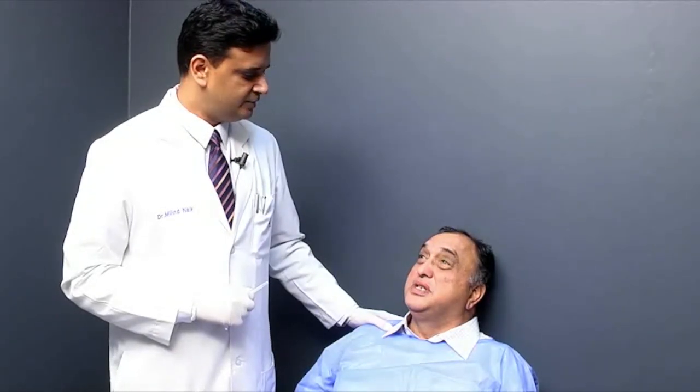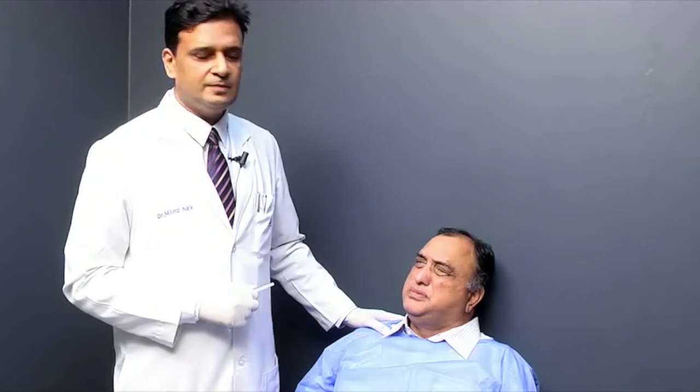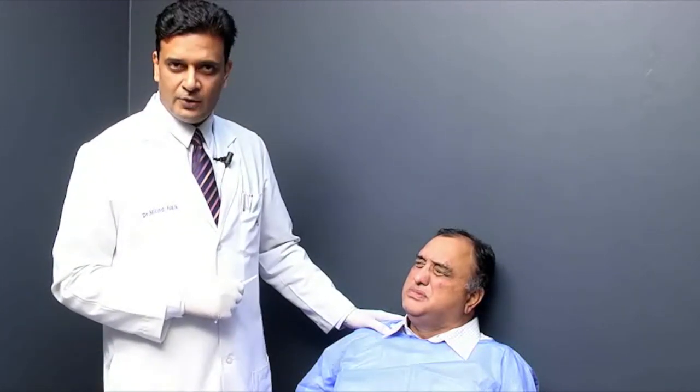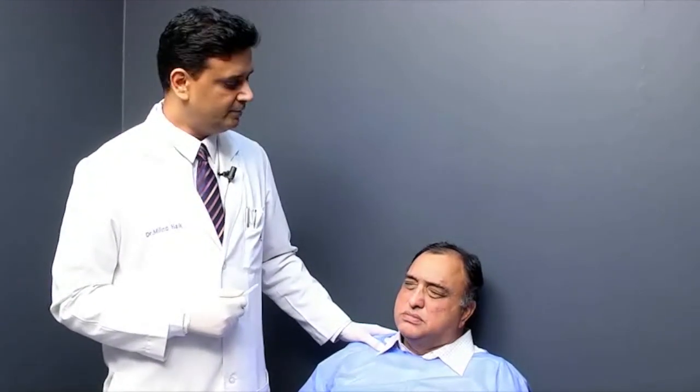We will prescribe lubrication eye drops to be used 4 times a day for at least 3 to 4 weeks, because the patient will develop lagophthalmos post-injection. The patient is also advised not to lie down horizontally for 3 to 4 hours after the procedure, as the Botox can gravitate across the septum and affect the extraocular muscles. He can resume regular activities immediately. The peak effect comes at around 2 weeks, though action can initiate at 3 to 4 days. Typically the effect lasts approximately 3 months, sometimes 4, and the patient returns for the next injection when the spasm begins recurring.